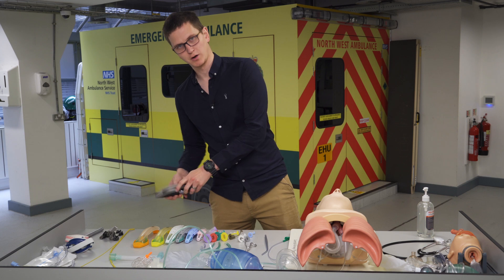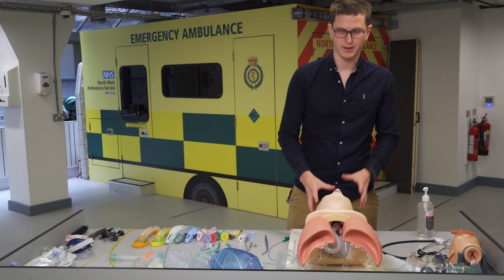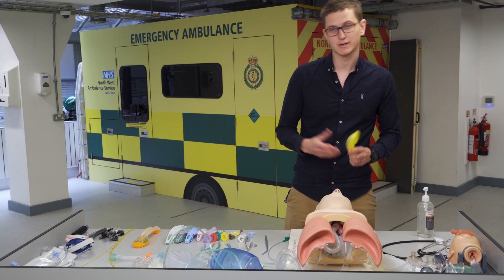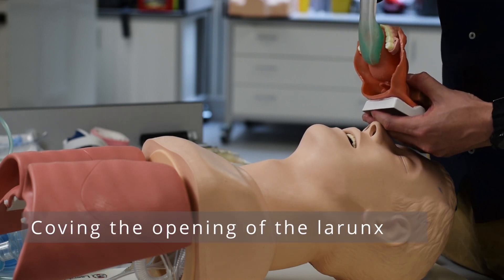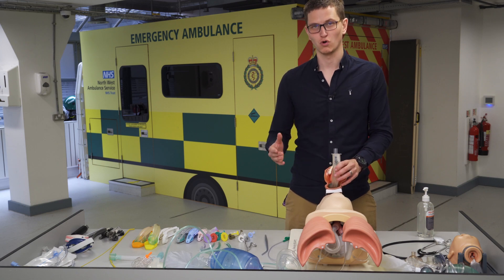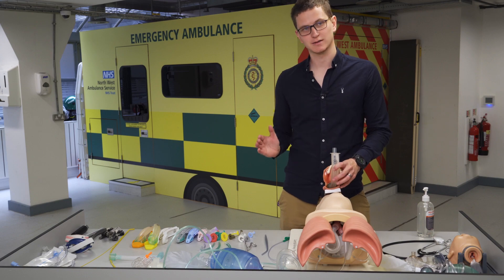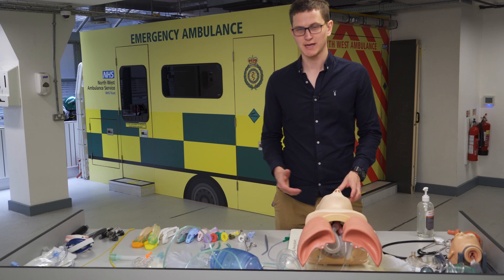Let's start off with supraglottic devices. We're going to talk about what they do, how they work, how we insert them, and what are the pros and cons. There is terminology for advanced airway: open, maintain, and protect.